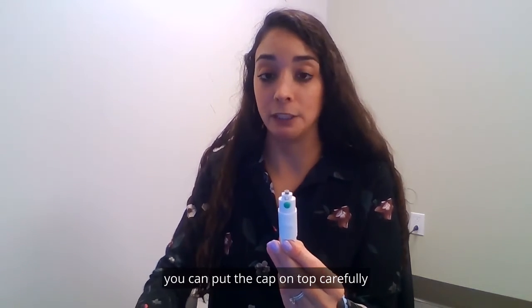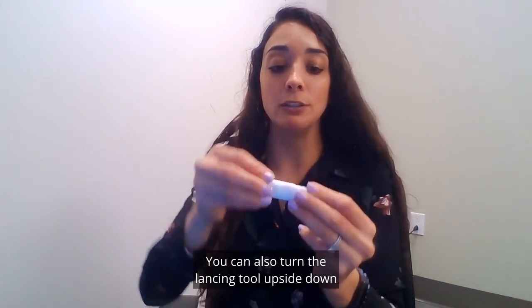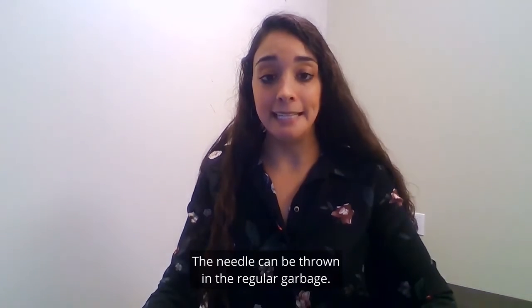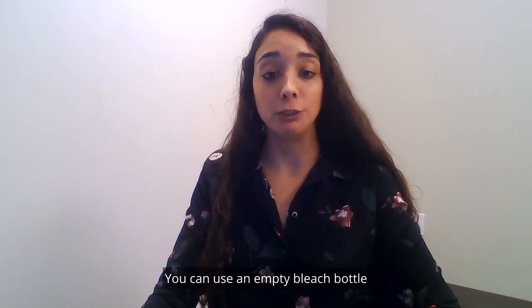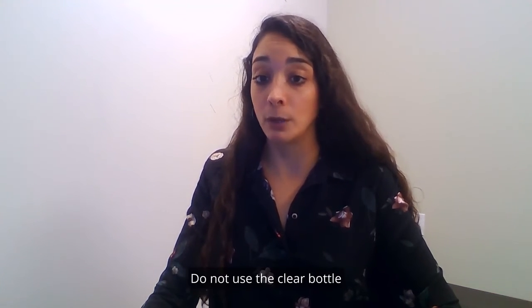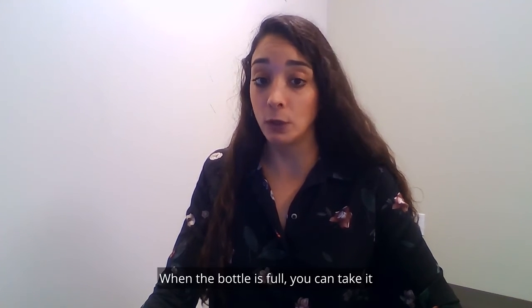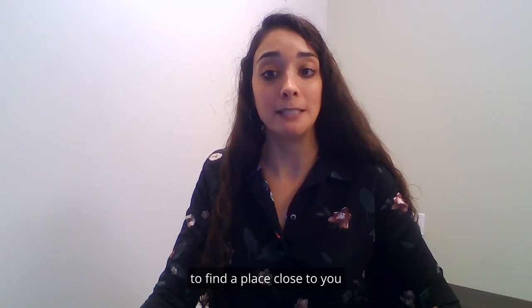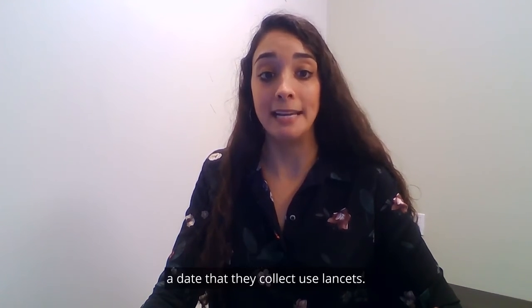To remove the lancet, you can put the cap on top carefully and pull it out gently. You can also turn the lancing tool upside down and pull out the lancet so that it falls on a flat surface or a table. The needle can be thrown in the regular garbage, or you can make a sharps bottle at home. Use an empty bleach bottle to put in all the used lancets — do not use a clear bottle or glass bottle. Make sure to write 'sharps' on the bottle with a marker or pen. When the bottle is full you can take it to any hospital close to you. Sometimes the city or town you live in will also have a date that they collect used lancets, and at the end of this video we will list a website to help you find a disposal location near you.